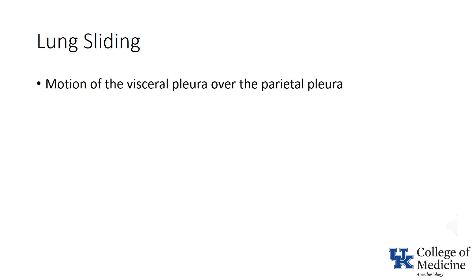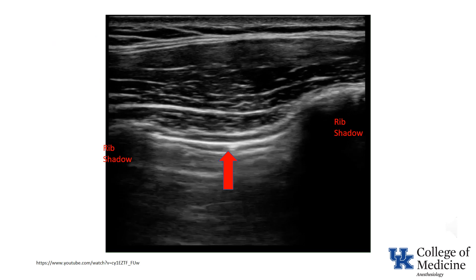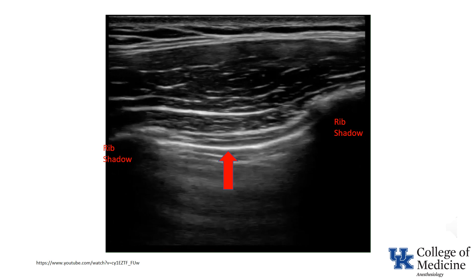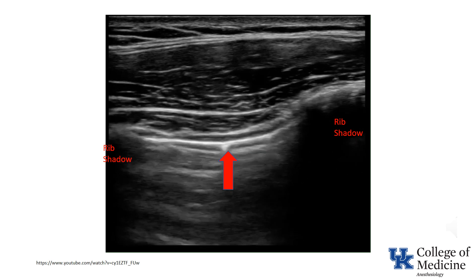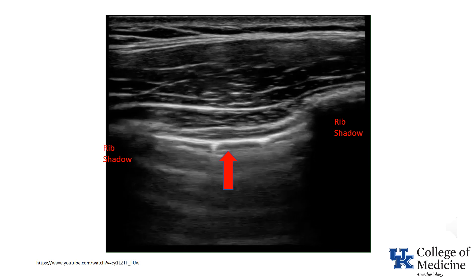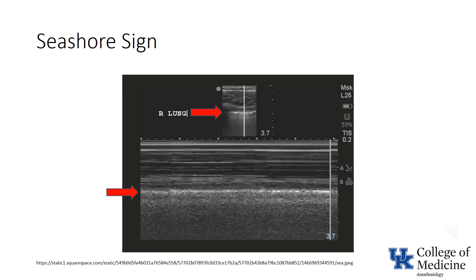Lung sliding represents the motion of the visceral pleura over the parietal pleura. By definition, lung sliding is a dynamic process. As shown in this video, it appears as shimmering or sliding between the two layers. Normal lung sliding may be represented by a still image obtained in M-mode, the results of which are termed the seashore sign. The parallel lines at the top of the image represent waves, and the granular texture below the pleural line represents the sandy shore.